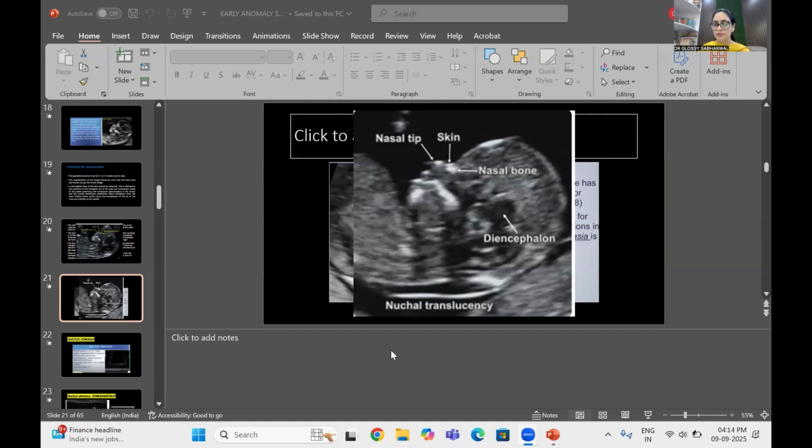Another question, I'm addressing the questions right from the top, and I'm happy a lot of doctors are asking how to get the sagittal view probe movement. If you look at our lectures, the probe movements are very clearly explained. If you are holding the probe like this and keeping it on the patient's lower abdomen, it will give you a horizontal image. Now, you turn the probe 90 degrees and it will give a sagittal image. However, these probe movements are better seen practically in the videos, which Mr. Sultan has. You can always get in touch with him.